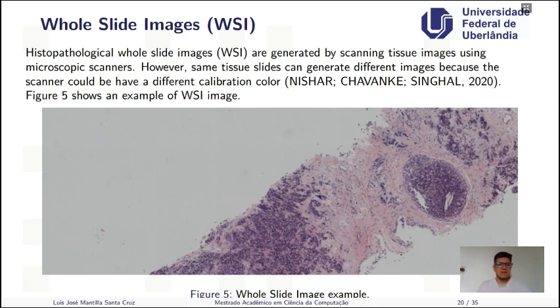Principal concepts. As a principal concept, we have WSI images. Well, basically, it is a histopathology whole slide image scanning. It's generated by a scanner which is usually calibrated with a color.